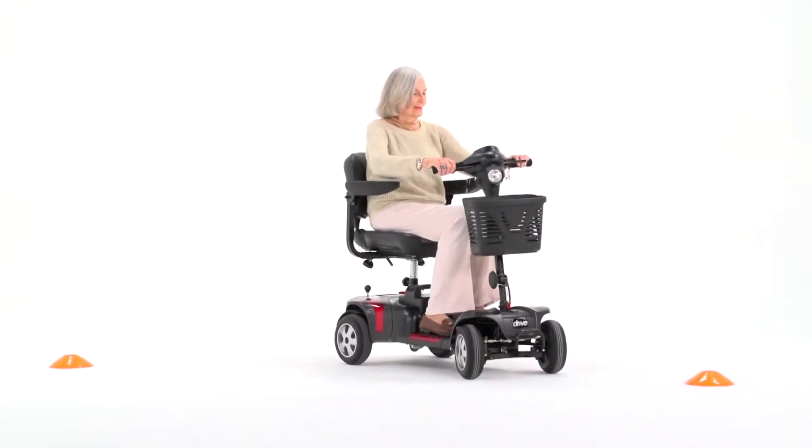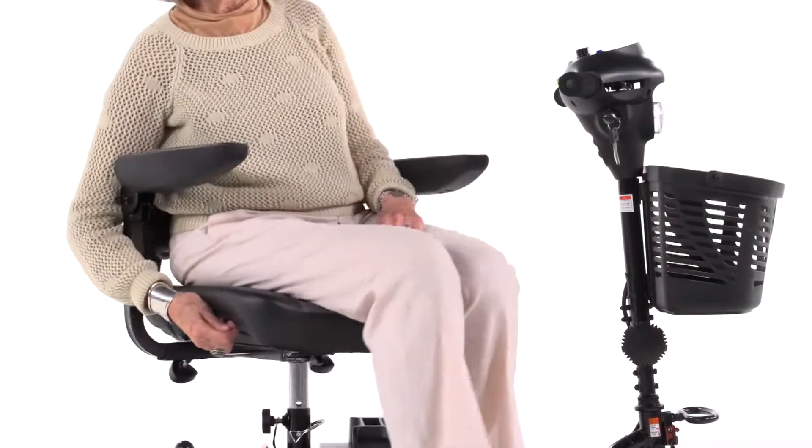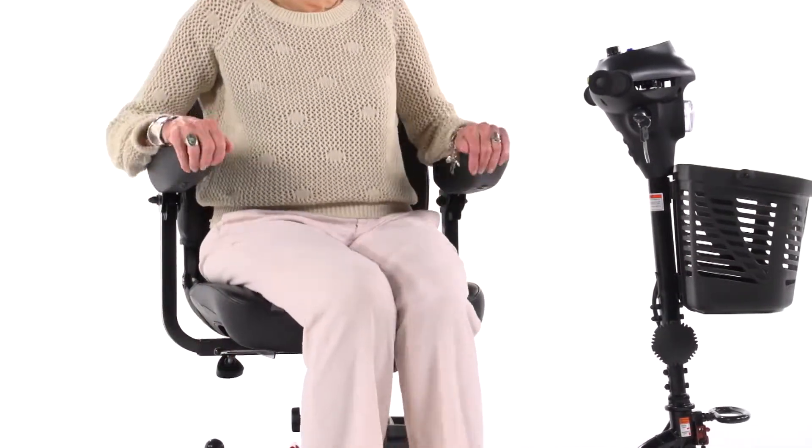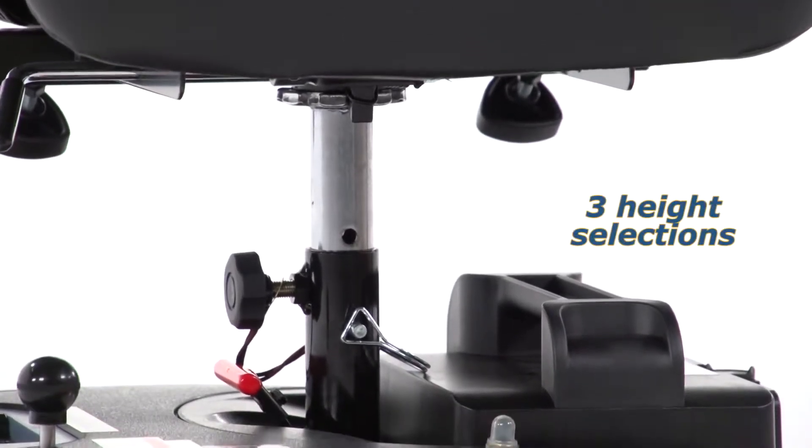Along with great performance, the Phoenix HD 4-wheel offers excellent comfort. The upholstered stadium-style seat can swivel 180 degrees, and also has three height selections to suit users of nearly any height.